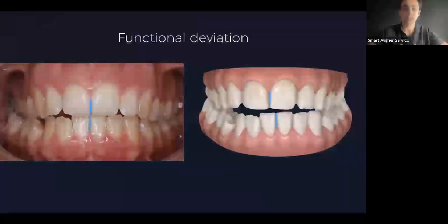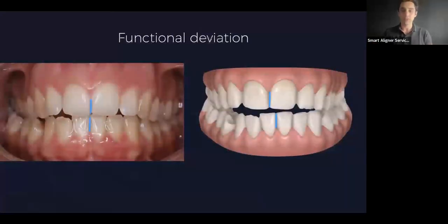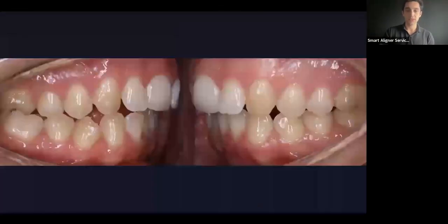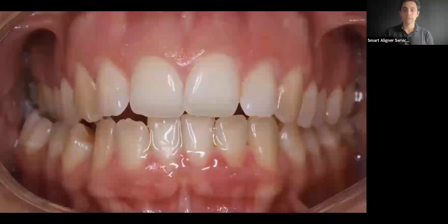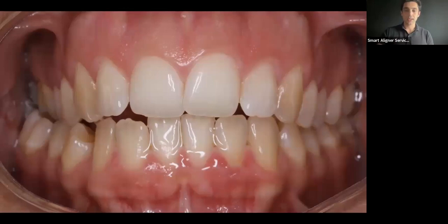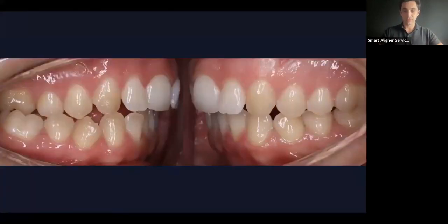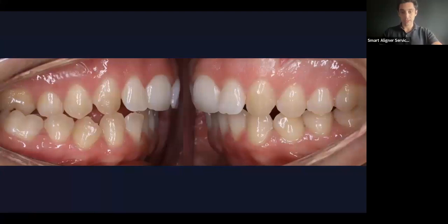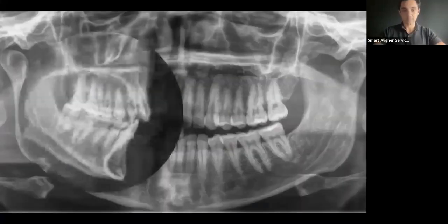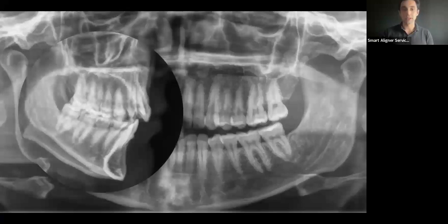Now let's think about how we want to plan this case. If we just check those pictures, we would say: I want to expand the upper arch more on the right side than the left side, and distalize both arches to solve the crowding problem. We don't want to procline too many lower incisors, because they are well positioned relative to the lower jaw, so we just want to distalize the upper teeth.